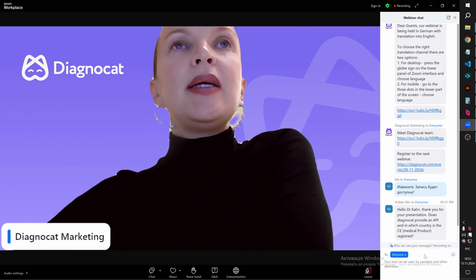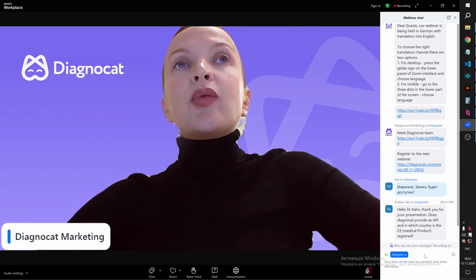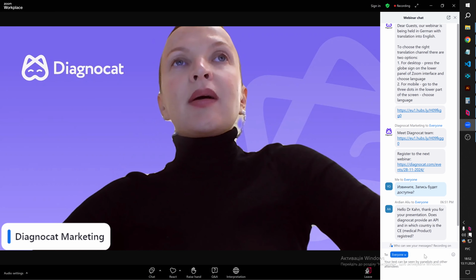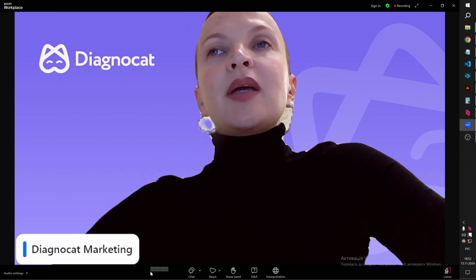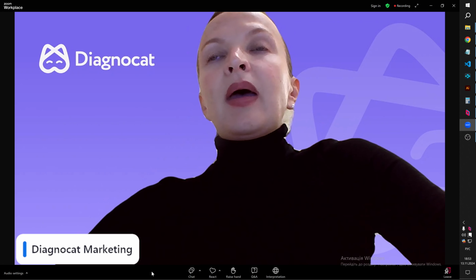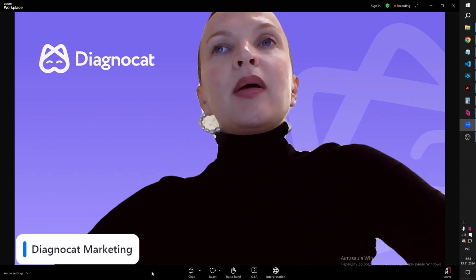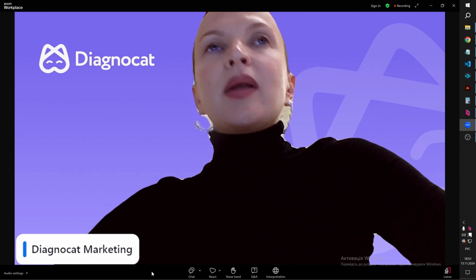About the CE mark, we do have it in the European Union for the current version of DiagnoCat 1.0. So next year, we are expecting another update so that all the features you have seen today will be available in all the European countries. And about API, I think we should align with our R&D team, but I know that there are cases when it was possible.